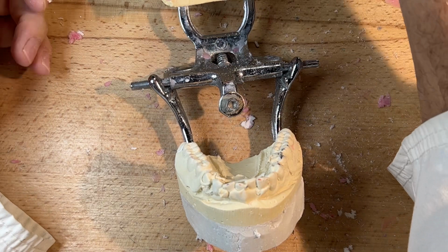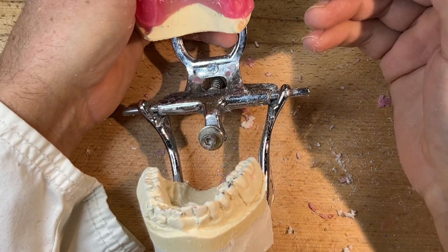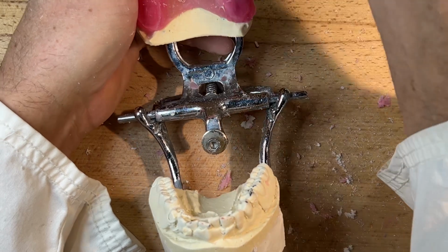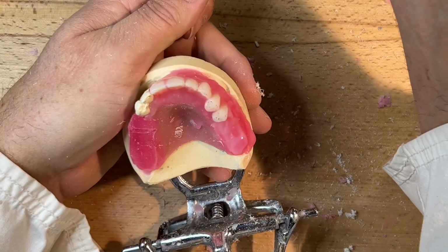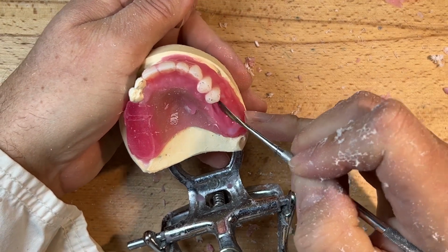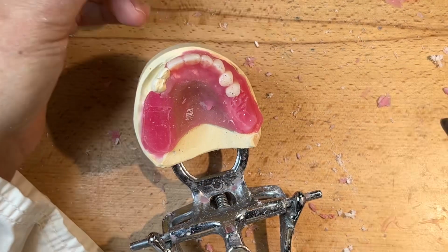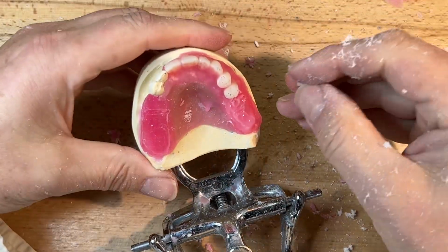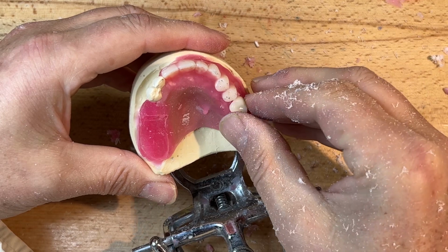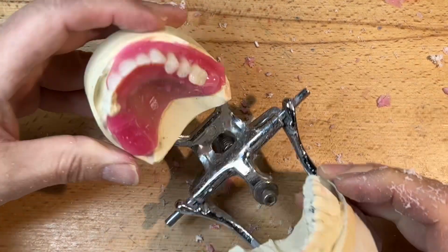Slightly narrower occlusal table, but I thought that might be advantageous being first time full denture wear. Here we probably don't have to do too much customization, even though we're doing one denture tooth brand against another, a different occlusal scheme. But I'm pretty confident that this should manage.